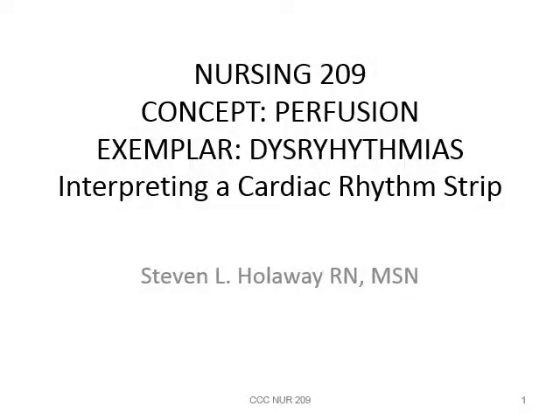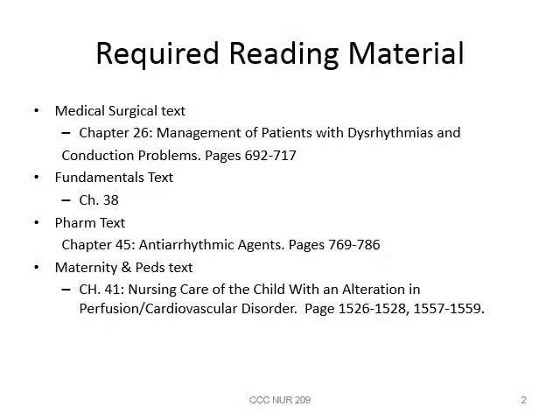Nursing 209. The concept we're discussing today is perfusion. The exemplar is dysrhythmias. We're going to be talking about interpreting a cardiac rhythm strip. Required reading is listed here.